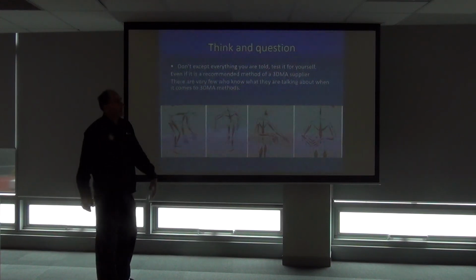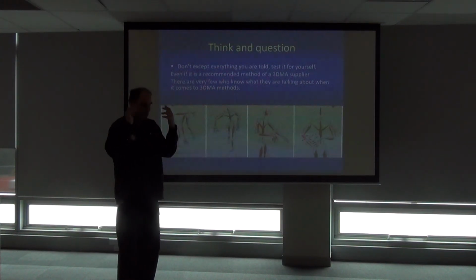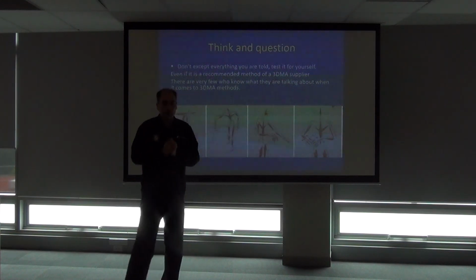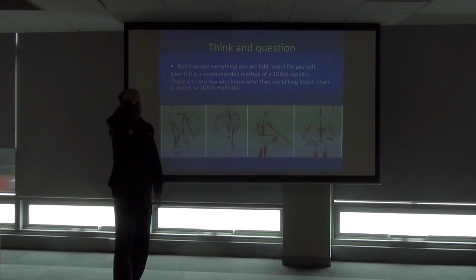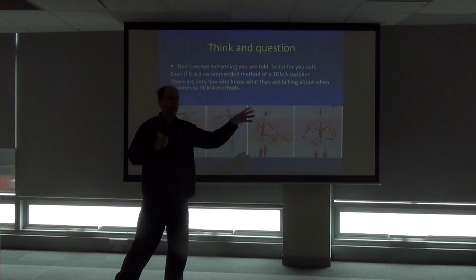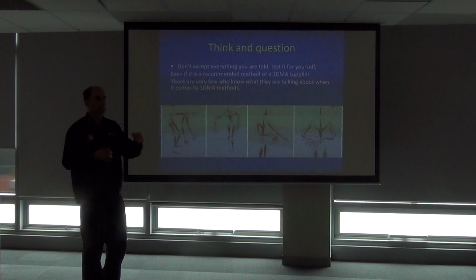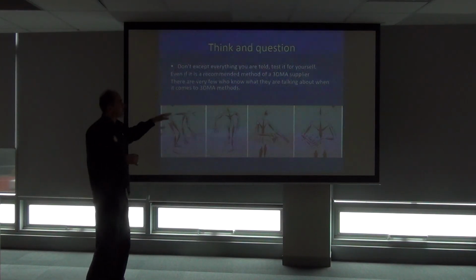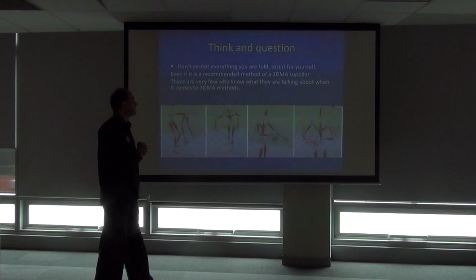Even if it's recommended by a 3D motion analysis supplier, you look at Vicon, you look at motion analysis, you've got Vicon's clinical gait marker set or Vicon clinical manager, that Vicon set for this. And motion analysis, you've got like Helen Hayes modified marker sets. These are some of the original marker sets back in the 70s and 80s. They were outdated in the 70s and 80s. Those are outdated at least 20 years ago, but they're still here, even though they're terribly unreliable.